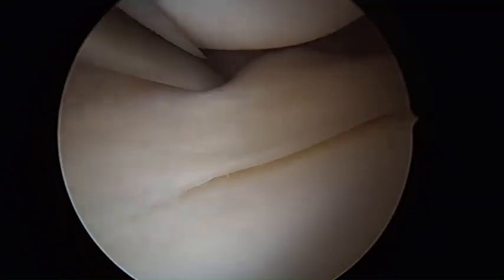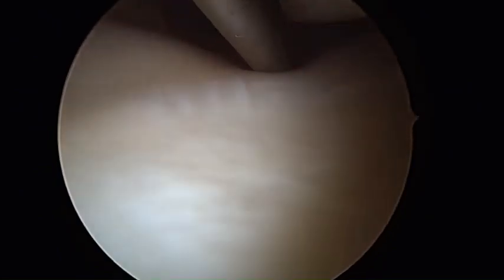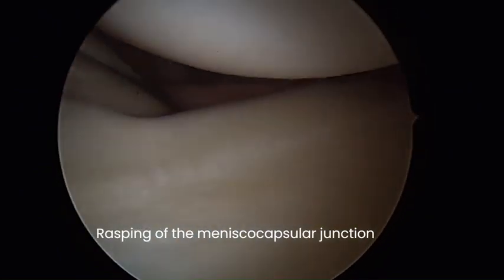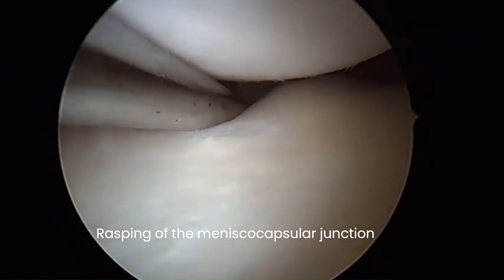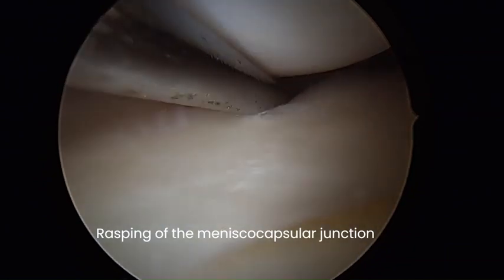The ramp lesion can be identified by using a probe to check for a gap at meniscocapsular junction, an increase in medial meniscus translation. We start the repair by refreshing the edges of the lesion at meniscocapsular junction by using an arthroscopic rasp to remove fibrous tissue and obtain vascularized edges.